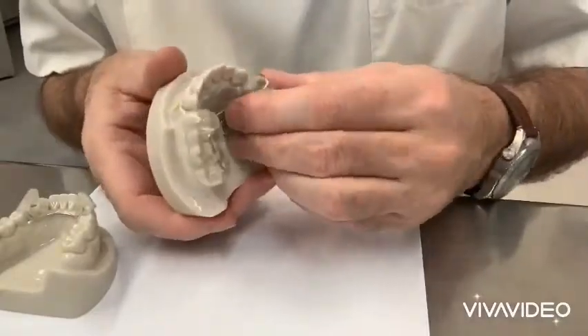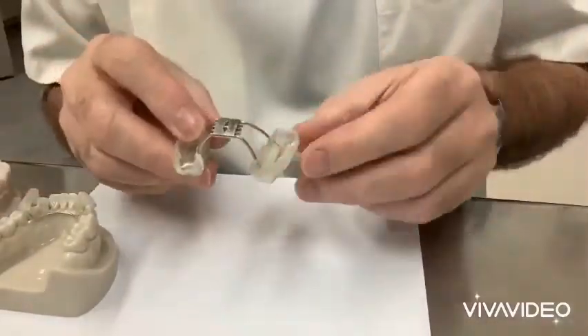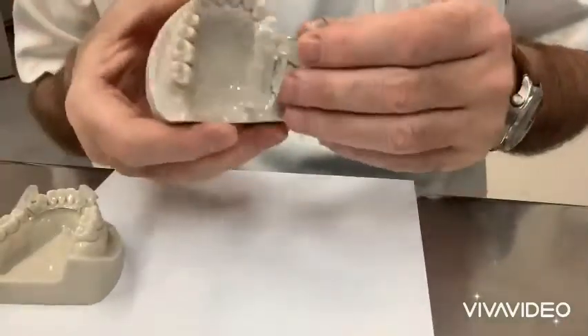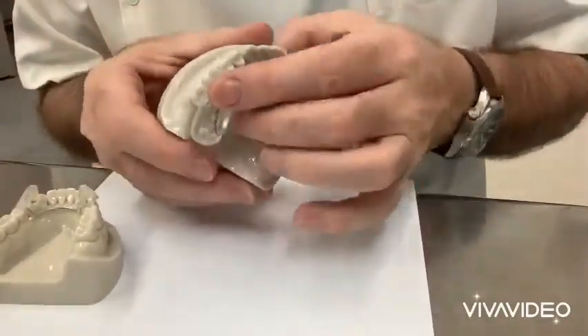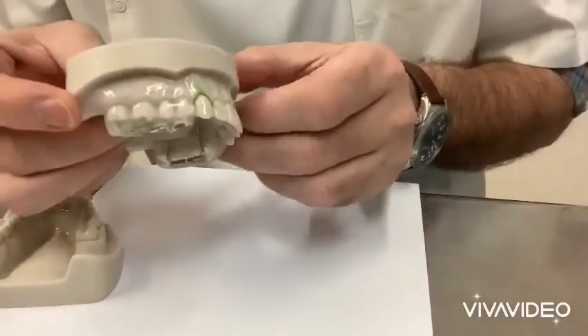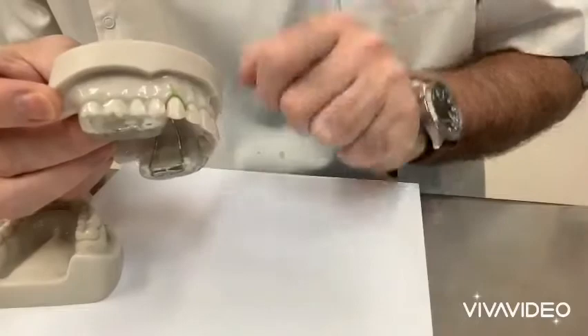If I take the top one off, you can see here it's all acrylic and you bond this in with cement. It clicks in here, and if you look carefully, you can see this is angled at 70 degrees.